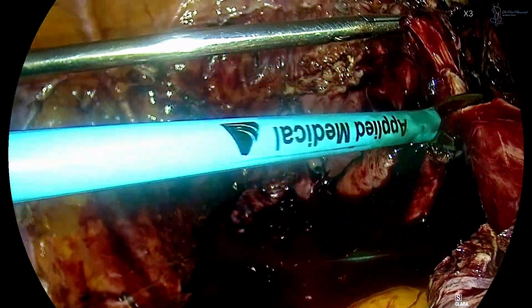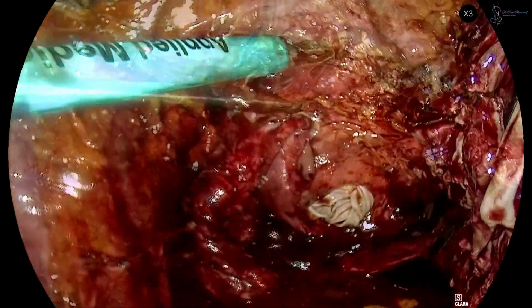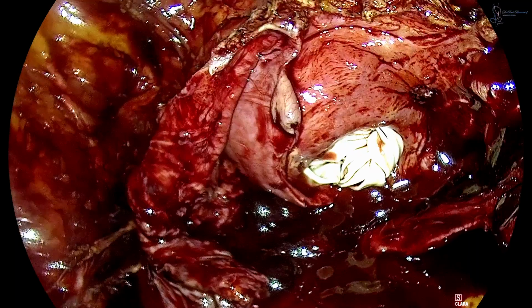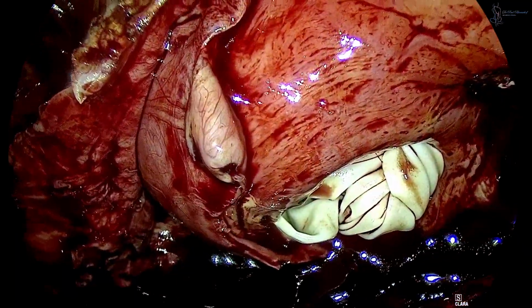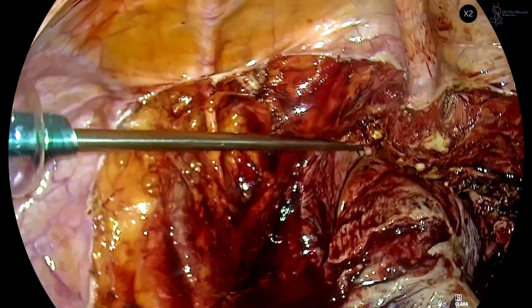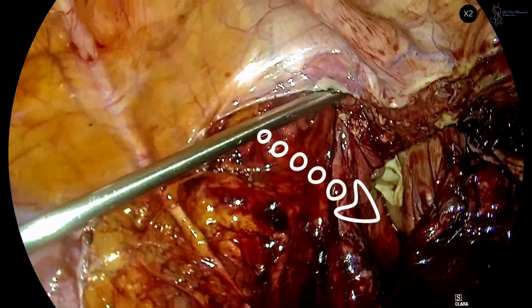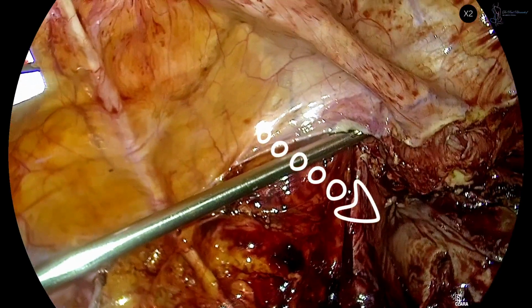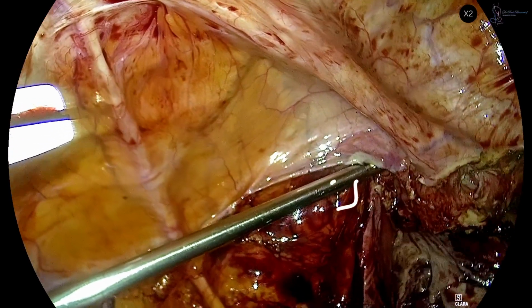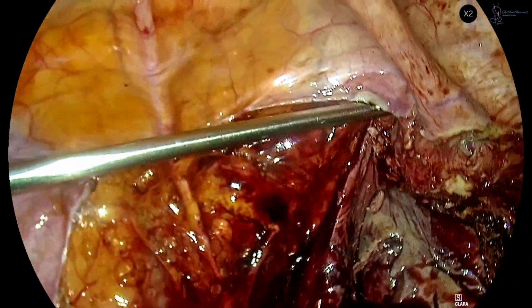The specimen was separated from the vagina by cold scissors. The cervix appears very dilated, and it is difficult to determine where the cervix ends and the vagina begins. After completing the colpotomy and ensuring adequate exposure, the small uterus was carefully mobilized and removed through the vaginal route. Gentle traction and appropriate surgical techniques were employed to facilitate smooth extraction while minimizing trauma to surrounding structures.